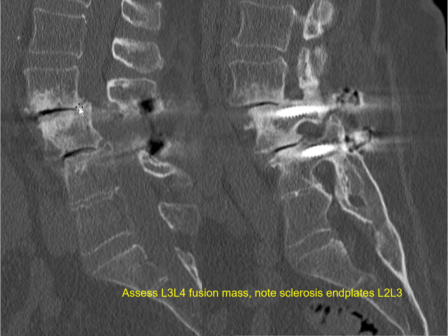You can see here on the CAT scan, L2-3 has a grade 1 spondylolisthesis, almost grade 2. The disc is gone, and it's very sclerotic, and she has really deteriorated very quickly over just 4 years. And I think it's because of her deformity. Basically her torso is anteriorly displaced, and this is causing stress at the first mobile segment.